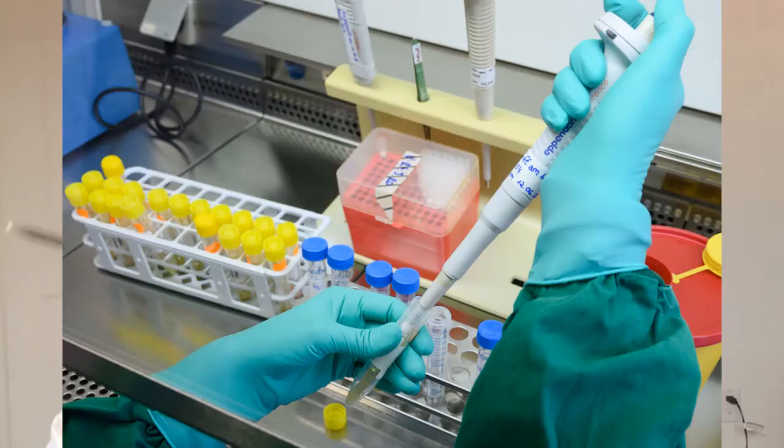The next step is that during extraction, the MLT makes a very complex calculation for a master mix that will amplify the viral RNA. Depending on what stage of the virus a patient is in, the volume of RNA can be very low. So the idea is to extract this RNA and amplify it. The amplification process is the way to multiply the RNA, so that when we put it in the machine, it will be able to detect these RNAs in the sample.